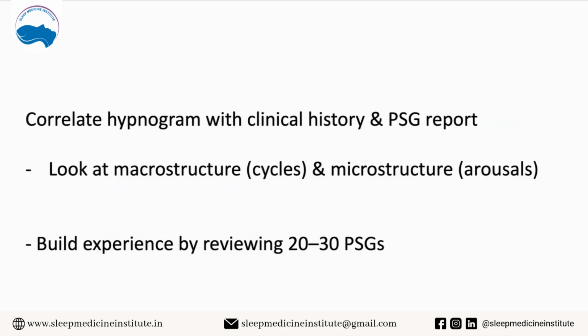So I do hope that this has been useful for you to understand what a hypnogram is and what the value of the hypnogram is. Thank you for your attention.